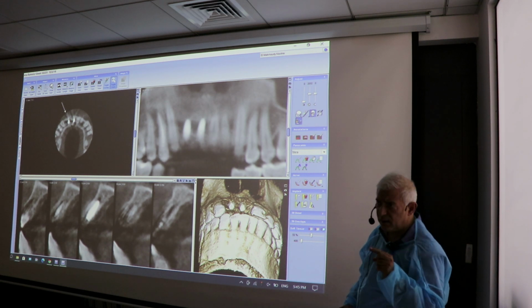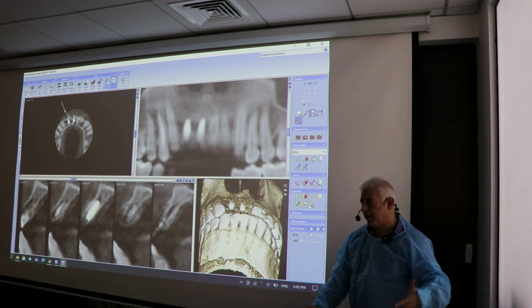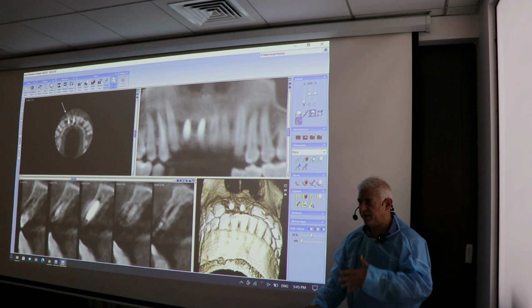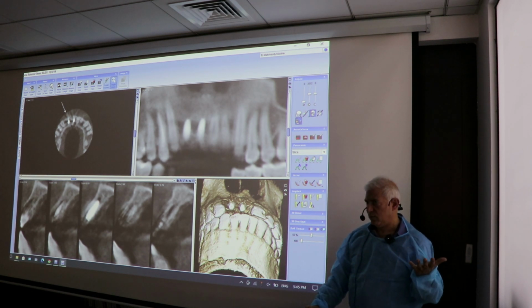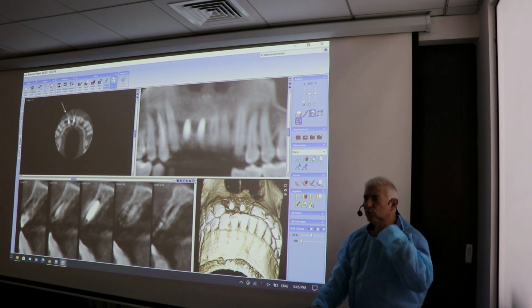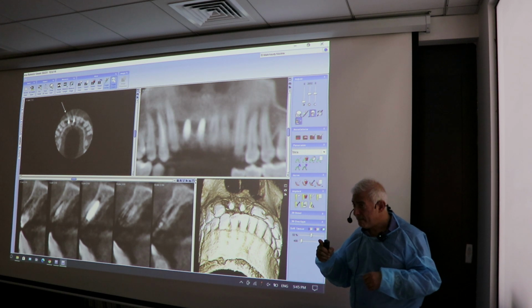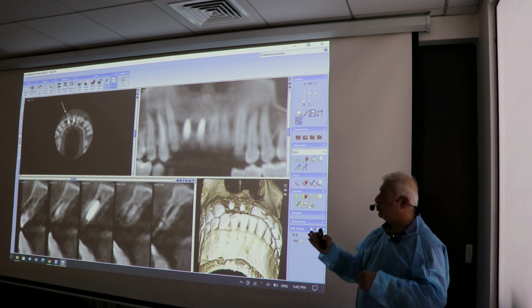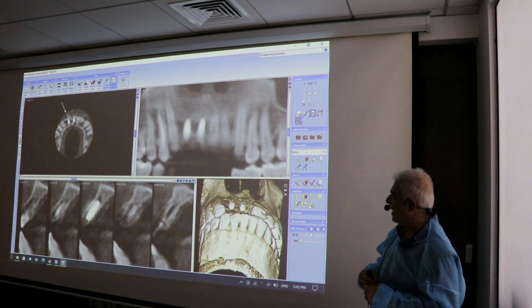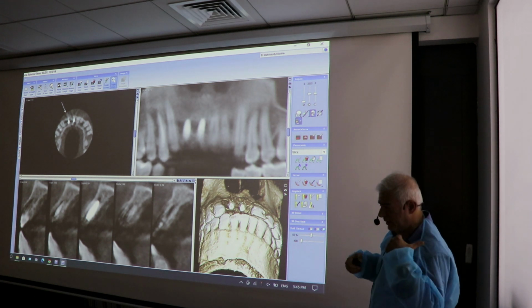Why? Because Versa, despite the advantages, also removes some bone. I prefer Hanaim. If I don't have Hanaim, I'll use Versa. But if I have Hanaim, I found I don't lose any bone. I go to slow speed, not 800, what Versa is suggesting. I put it on normal, forward, and I go to 100, not 800, and I don't do reverse. And I find I get a slow push with that. Hanaim, yeah. And the new one, the red kit, not the black kit.